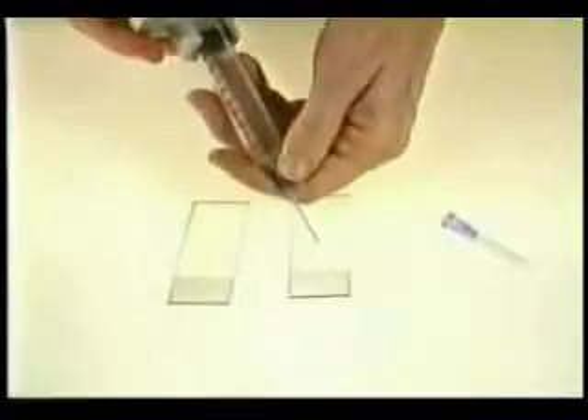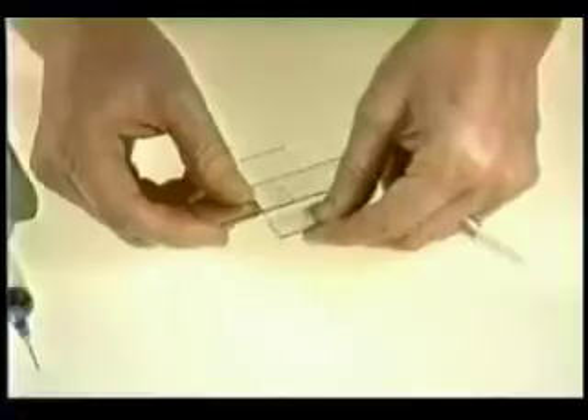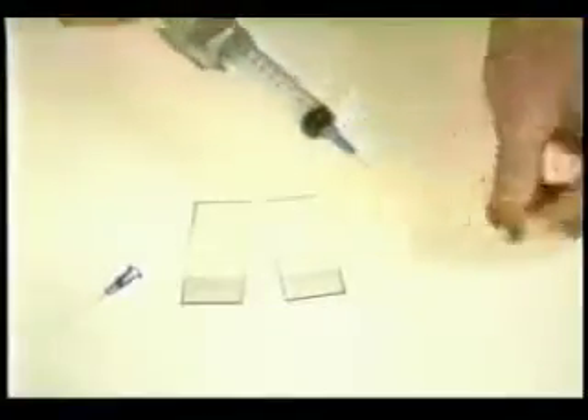Reach for the sample and have the workstation ready with all the equipment within a few steps. A new needle should be used for each additional sample in order to facilitate expulsion of the harvest and to avoid introducing already clotting blood into the subsequent samples.